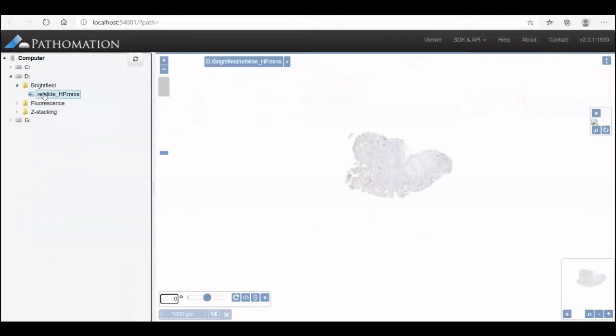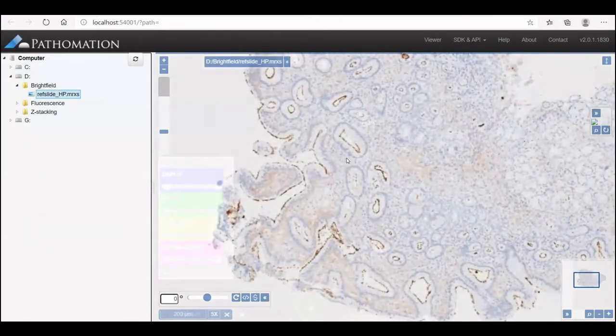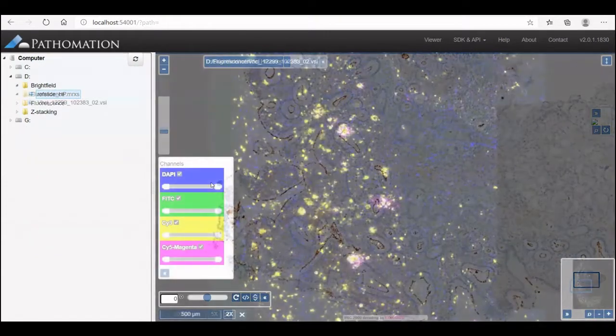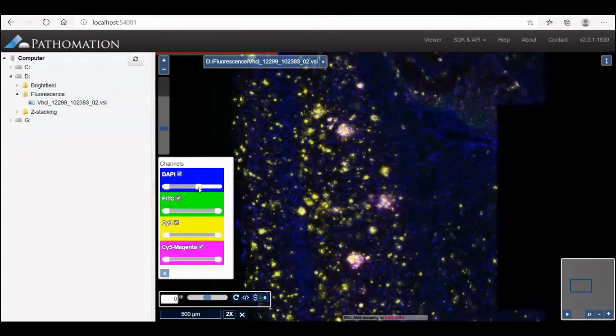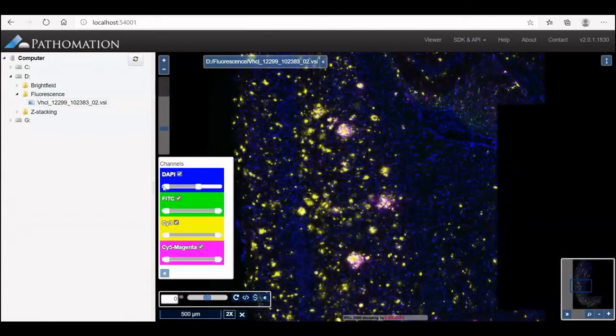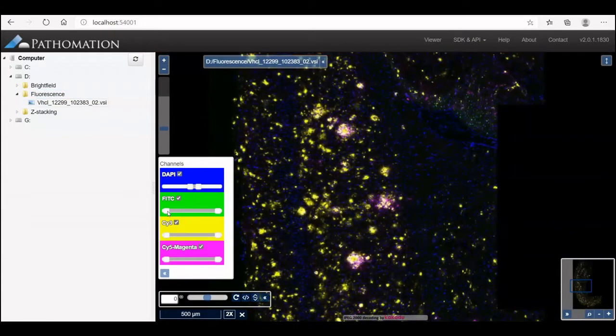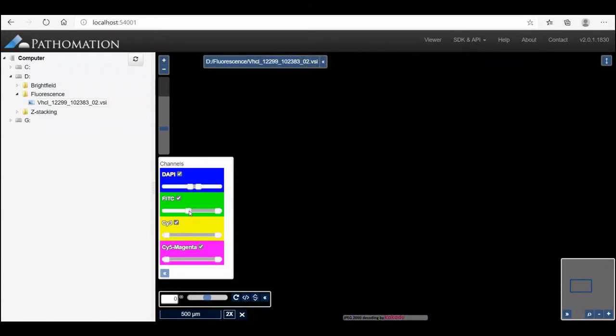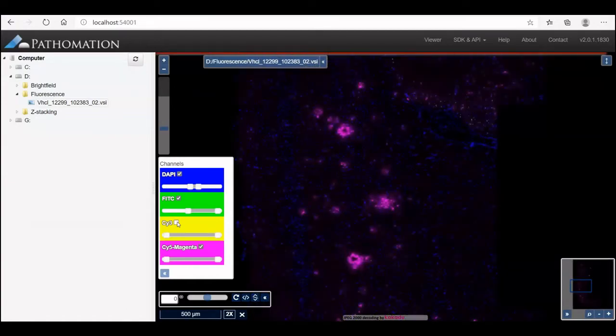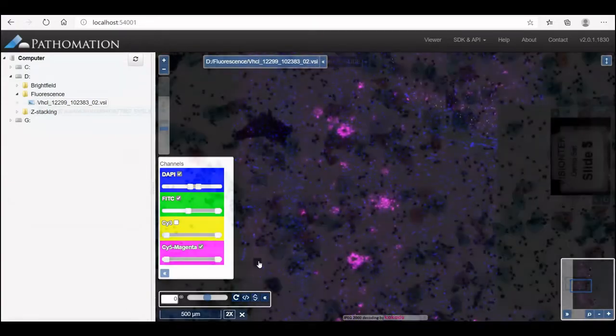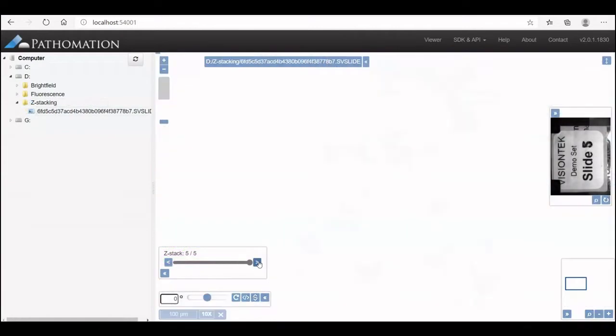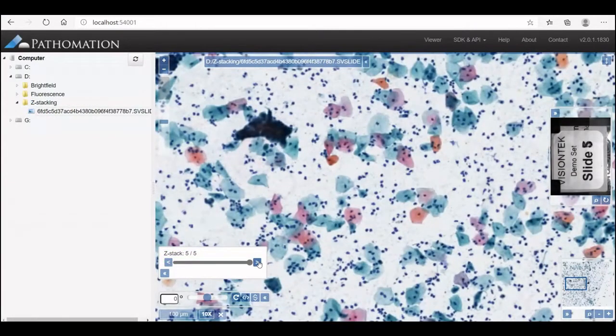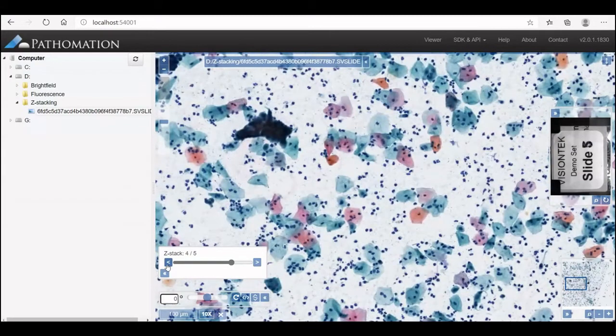With PMA Start, you can view and analyze brightfield images, fluorescence images of which you can change the histogram range, and last but not least, Z-Stack images, where you can adjust the Z-Stack level.